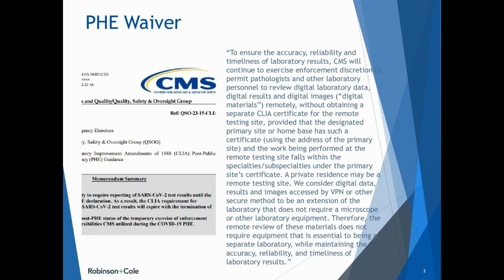And so this is really important, and they put parameters around what they consider digital data. And it's really important to think about this, and that given that this is an enforcement discretion, that doesn't make it the rule of law. And so this is something where CMS could change their mind. And it's important just to make sure anytime you're assessing any type of digital pathology arrangement, whether this is still in place or not.